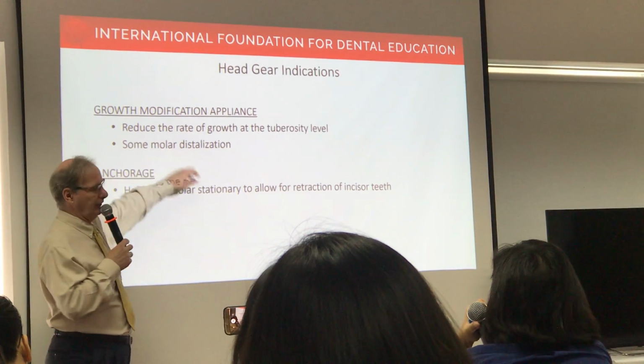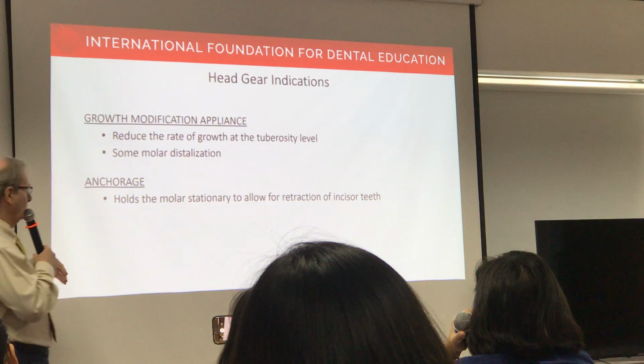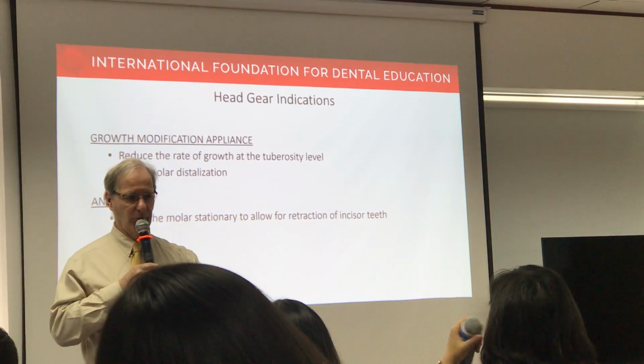I'm going to disrupt the class 2, the molar will tend to rotate, disrupt the occlusion, which the occlusion is a very good retainer. So maybe I'm kind of hoping that the lower jaw will come forward by itself.